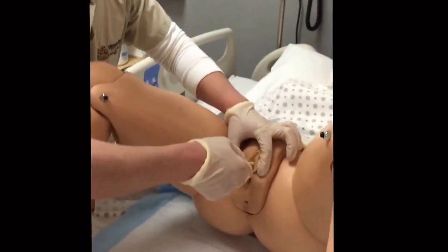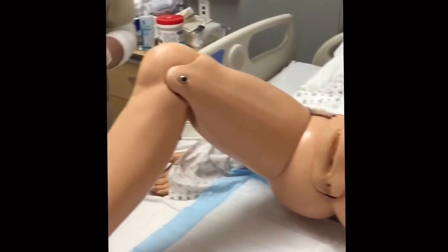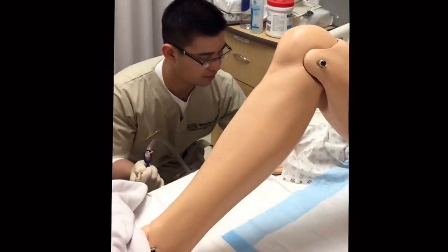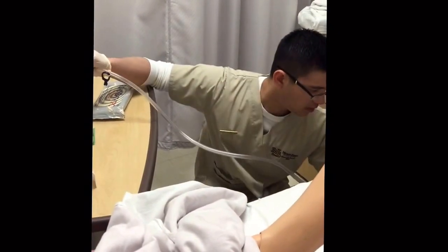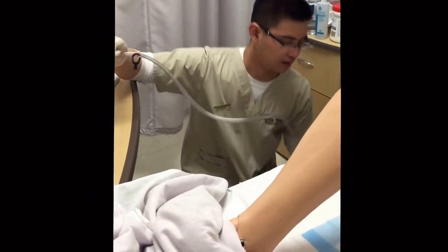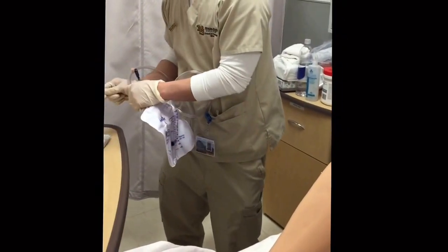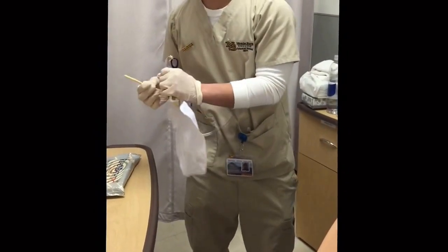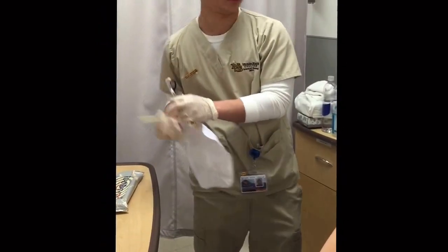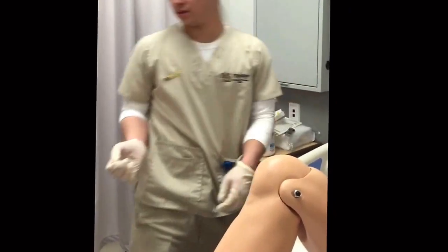So make sure when you pull it, just keep pulling it. And here you go, you're done. And once you're out of this, you can take this off. Let's take this out. And you can go ahead and discard, and make sure that you check for any discharge or anything. You might have to send this to the lab if you have to, but it looks like it's good. And make sure you're not showing the patient. So you can go ahead and discard this if you don't need it. So once you're done with that, you can go ahead and do hand hygiene.